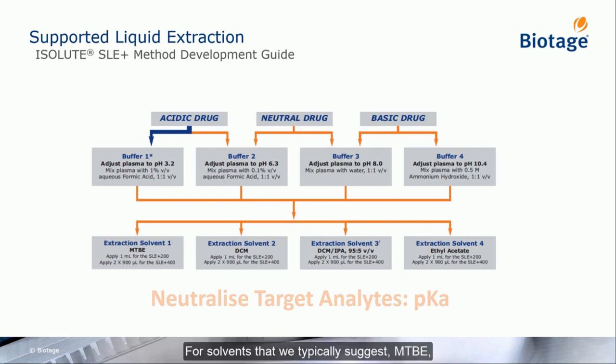For solvents that we typically suggest: MTBE, dichloromethane (DCM), and then for slightly more polarity, DCM:IPA in the 95:5 ratio, or ethyl acetate. So again, depending on the types of drugs you're looking for would dictate which solvent.